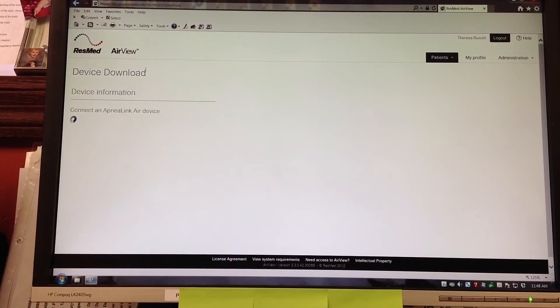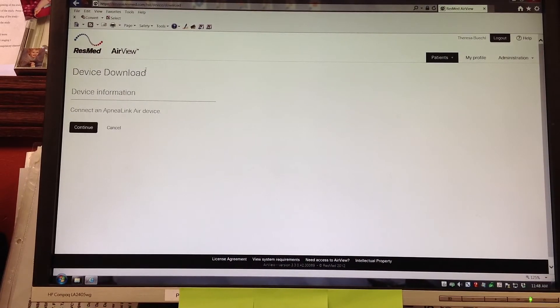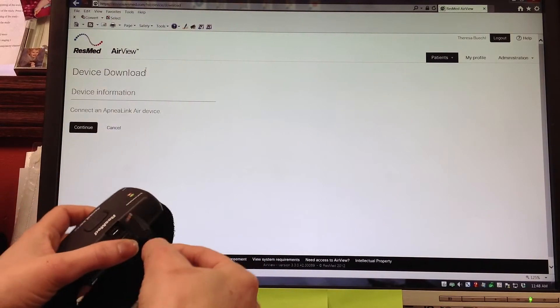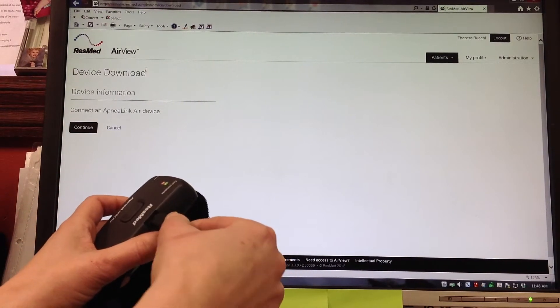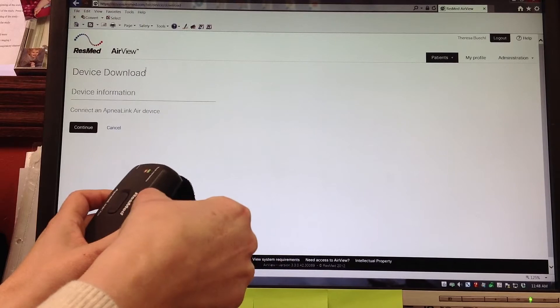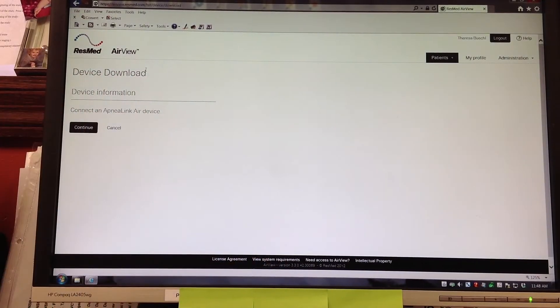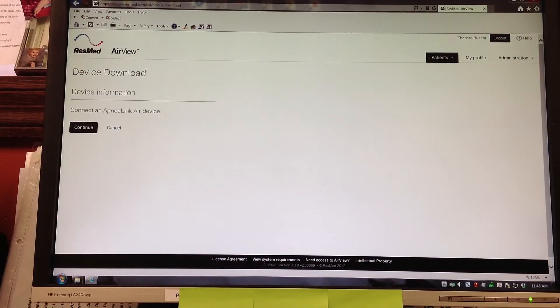Next it's asking her to connect an ApneaLink Air device. She is going to put the mini port into the ApneaLink Air device which is already attached to the desktop, and then she is going to select and click on continue.